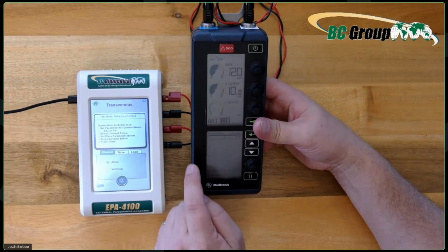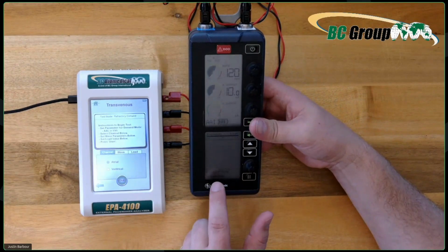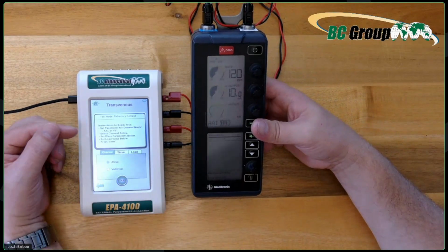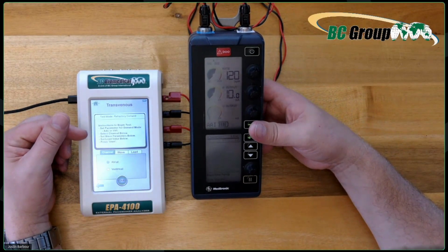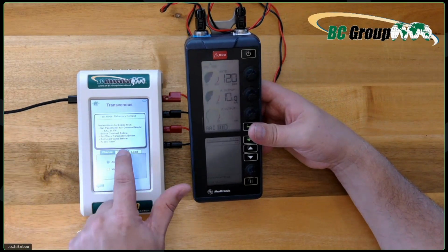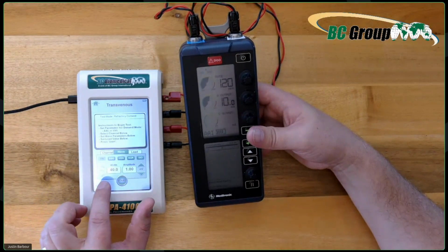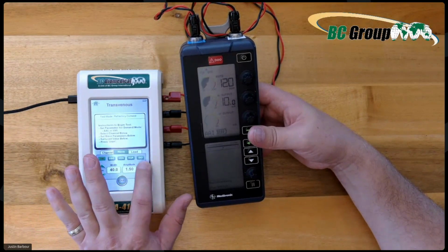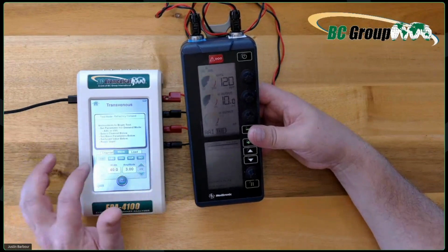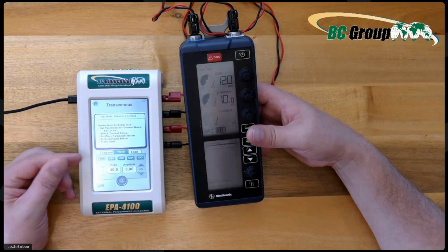The Medtronic does have a kind of dimly lit screen, and it's really fine font, so it's not the easiest thing to show up on camera, but I'm doing the very best I can. It says select the channel below, set the waveform parameters below. We have submenus. We can go into wave. And here's where you can set up the different parameters of the wave. The width, its amplitude, set to 3 millivolts. And I don't pretend to know what all these are. I would assume is a triangle wave.